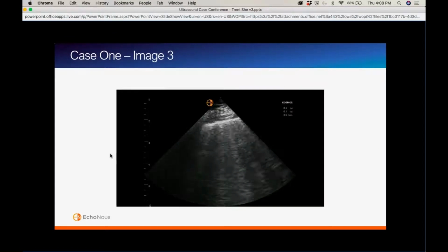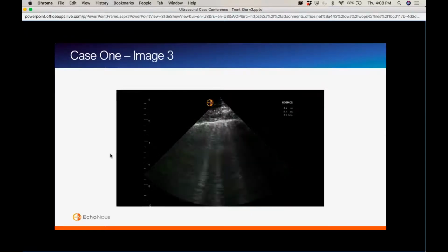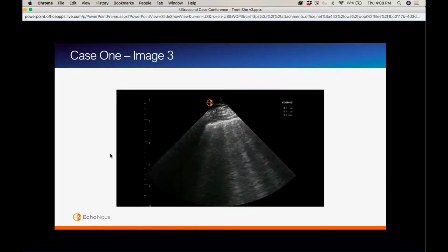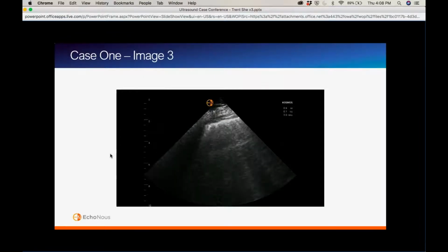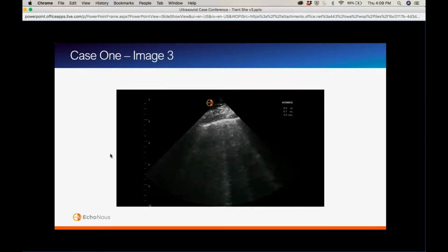Yeah, that's a great question. What threw us a little bit is that this was during the time when we had seen quite a few patients in New York City with COVID, and we were seeing a lot of this type of lung ultrasound with COVID. The kicker in the story is our patient tested negative for COVID twice, so we were initially thinking away from COVID.